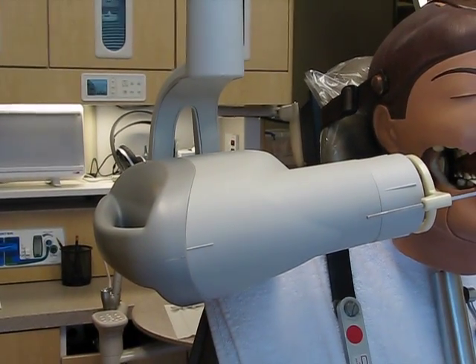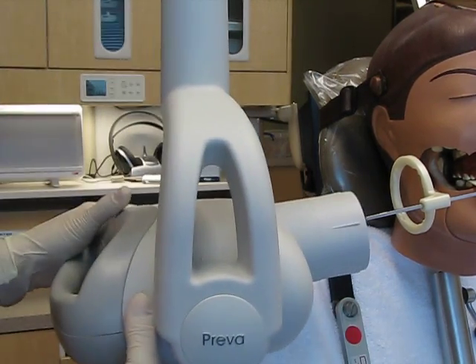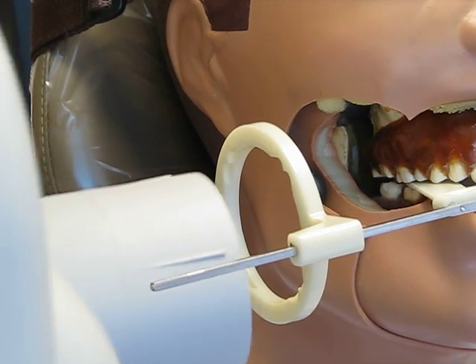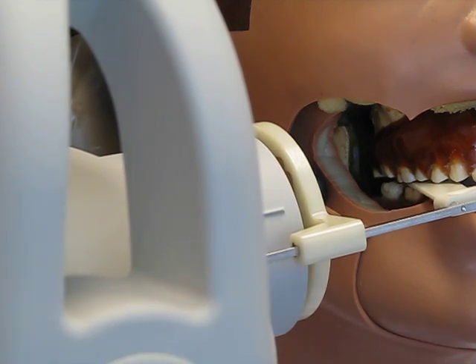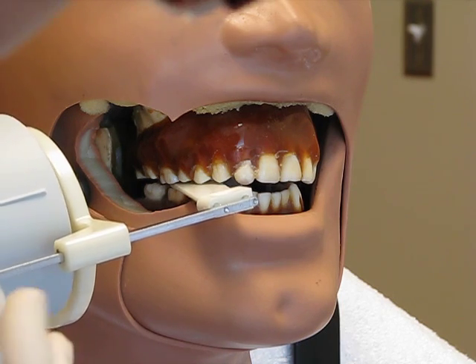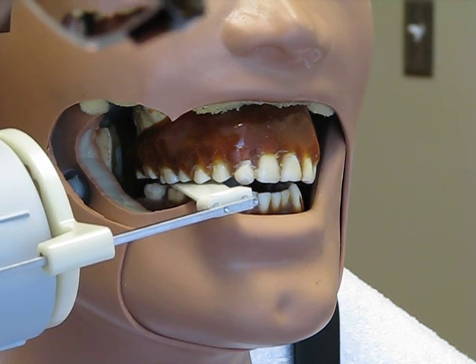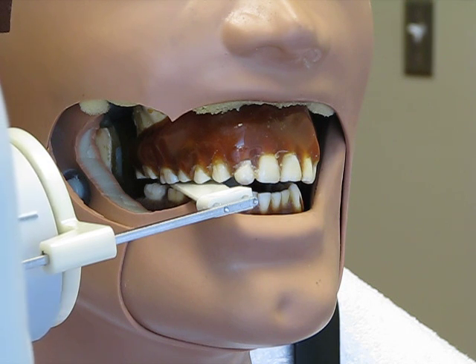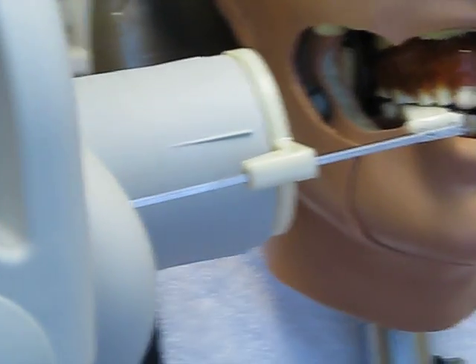The tube head is hitting the chair. So what I need to do is move this back and just turn it, giving myself more room on this side. Zoom back in so you can see. Come over here. Now I try to get my rod and my indicator as parallel as I can without getting in the way. If the rod hits the cone, what you need to do is bring the ring back a little bit. Then I look to see if my lines are parallel. And I'll bring you over here so you can see how it's parallel.